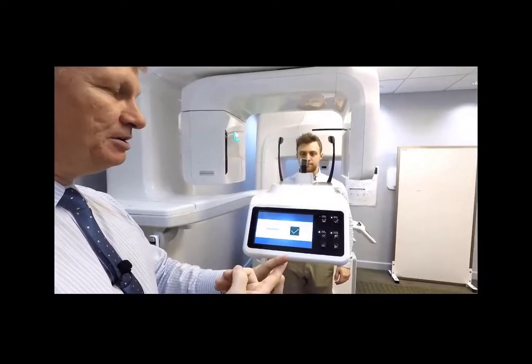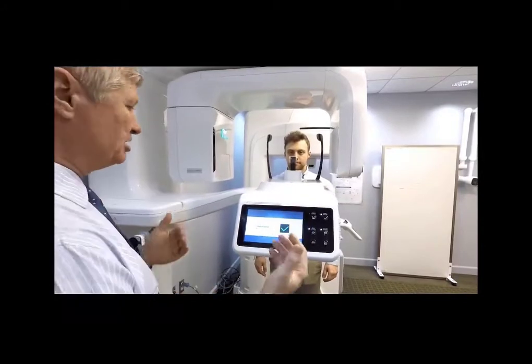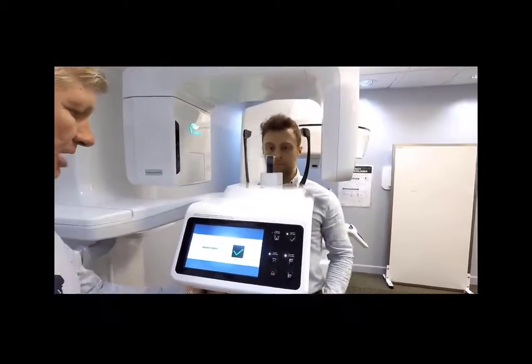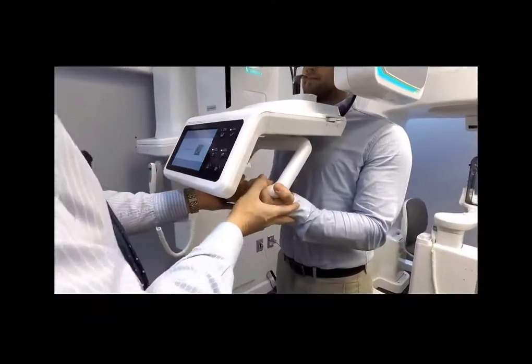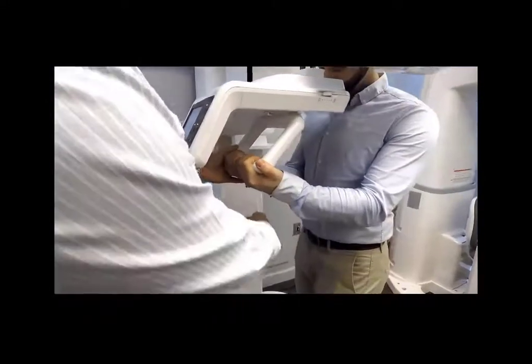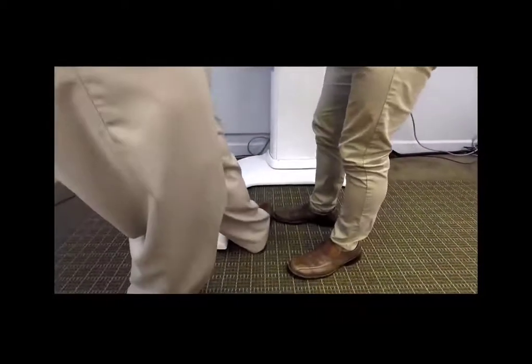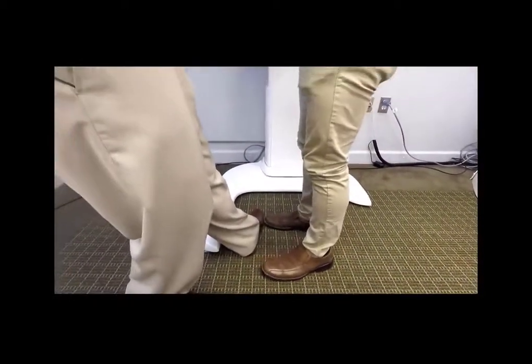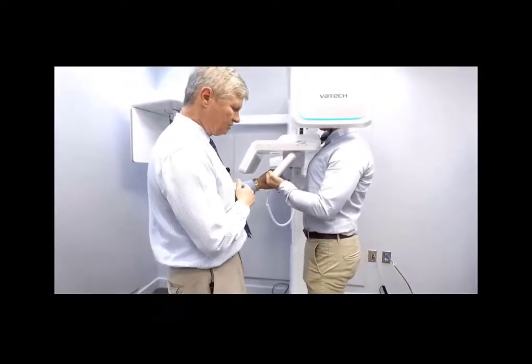Identify where the hands need to be, where the feet need to be, and where the mouth needs to be, in that order. So patient, come on forward if you would please, and put your hands on the very bottom of the bar here, palms facing up towards the ceiling. As far as your feet, I like to have them align with the right hand side of the column over here, and slide your feet forward just a little bit till they hit my feet right there. Great. And also make sure your feet are shoulder width apart to create greater stability for us as well. Terrific.